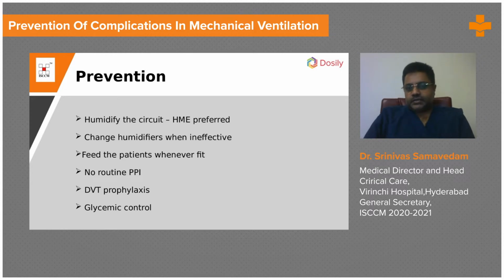Humidifiers. This is something which we all need to be aware of. If you are intubating the patient, you are actually bypassing the normal humidification mechanism of the nasal mucosa. So even if you put a patient on non-invasive ventilation with oxygen requirement more than 40%, the higher oxygen concentrations and the flows that are associated with it will prevent the air from getting humidified by the nasal mucosa. So some form of humidification is mandatory.